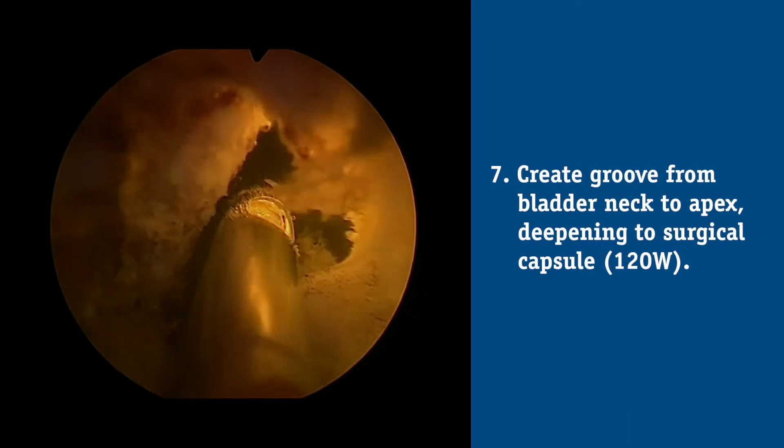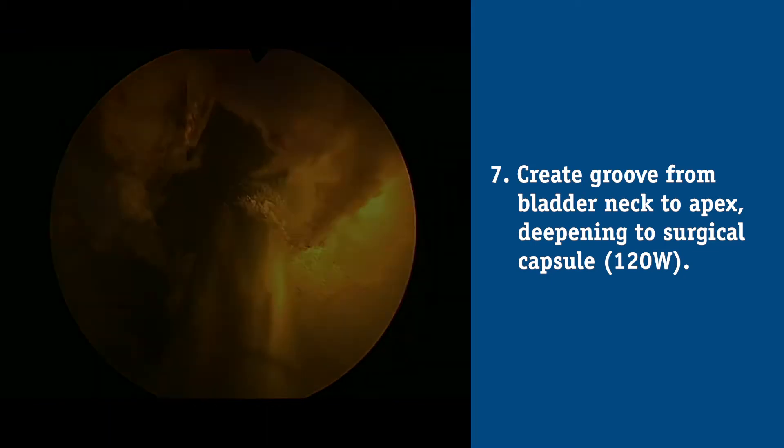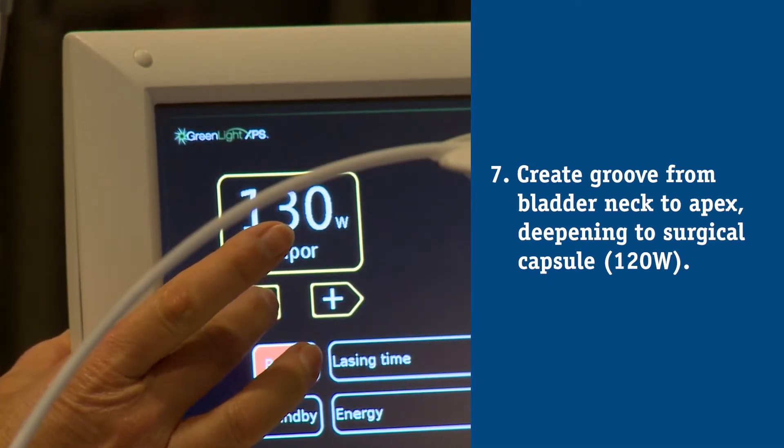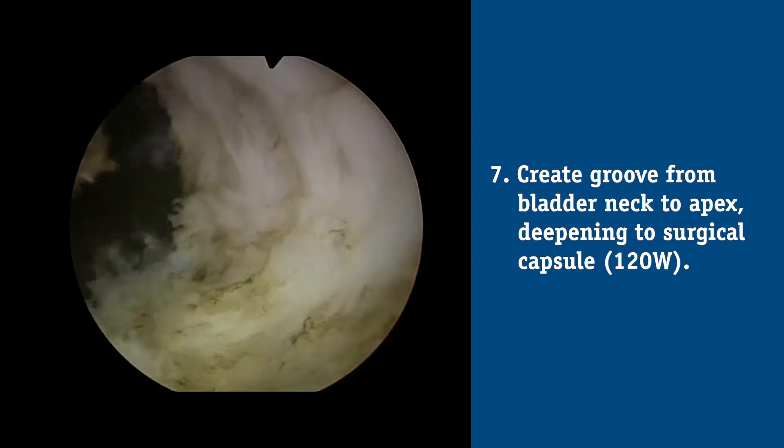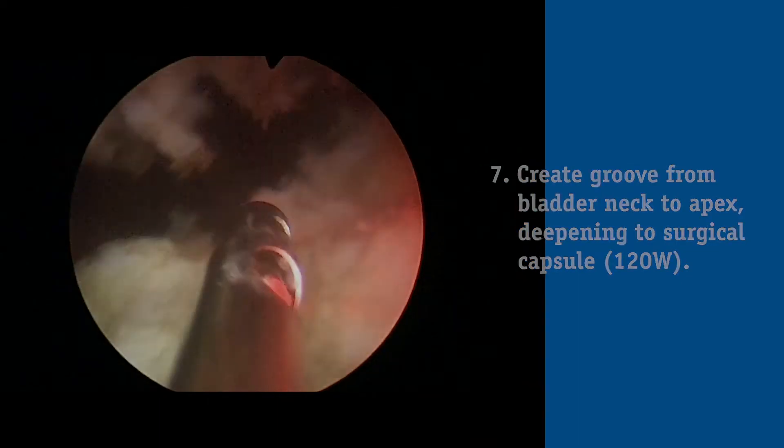Once I've completely removed the obstructing tissue from the median lobe, I turn to one of the lateral lobes. Usually the first lateral lobe I treat is the left side. I make an incision or groove on low energy between 80 to 120 watts between 1 and 3 o'clock, starting at the bladder neck and working distally until I identify the endpoint — the circular fibers. Once I see that, I walk down the wall with the laser to pedunculate the tissue between the groove at 1 to 3 and the groove initially made at 5. I then come to the apex and demarcate it with the laser in a retrograde manner, working away from danger, keeping the sphincter behind me.